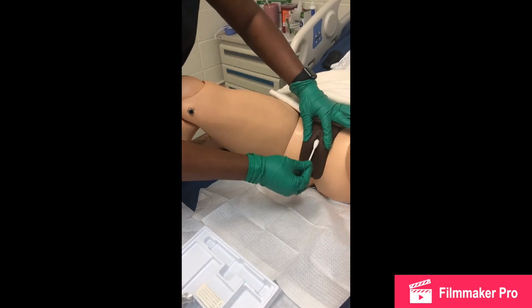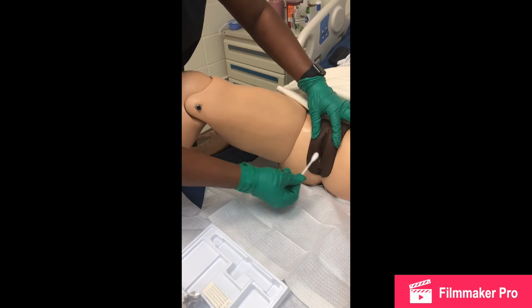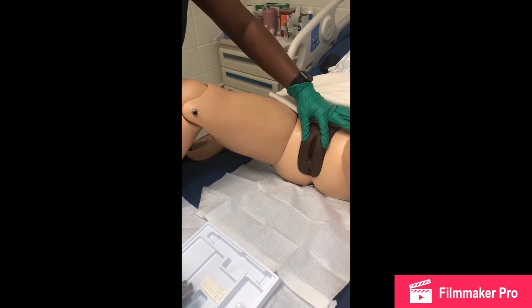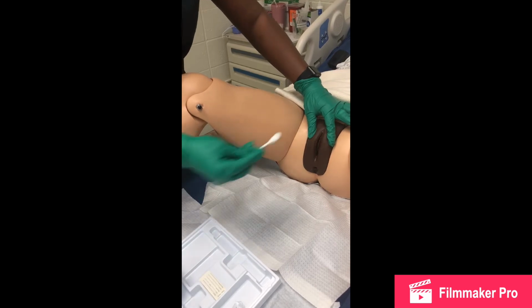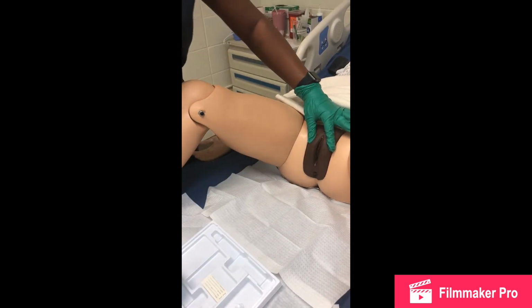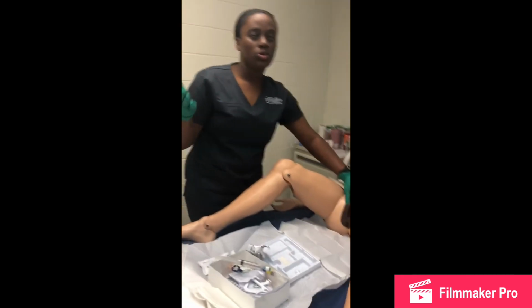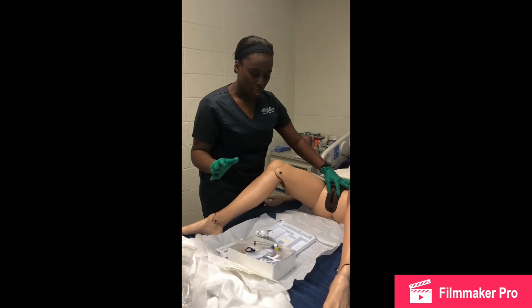And I'm going to go on the inside. Then I'm going to do one swipe in the middle. It's careful to note that while doing this procedure, you communicate with your patient to make sure that they're comfortable and all of that.